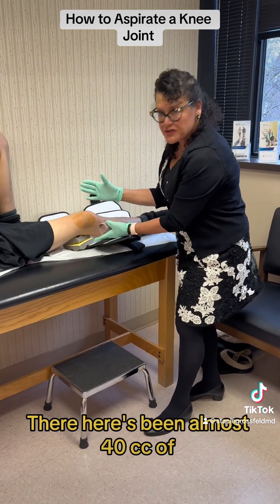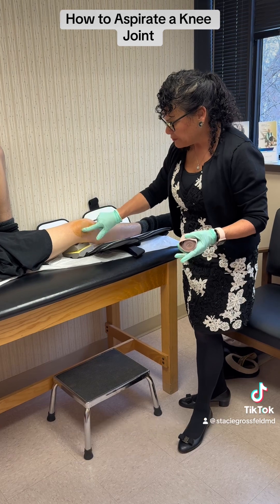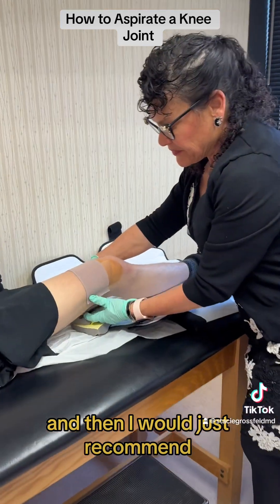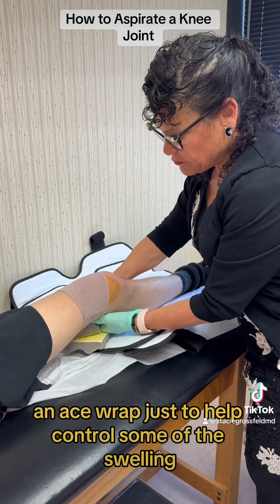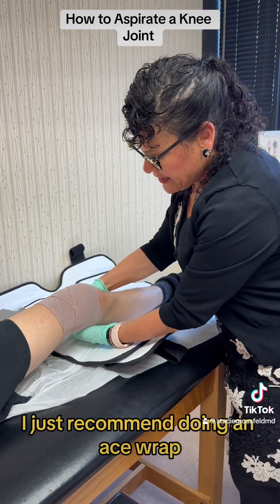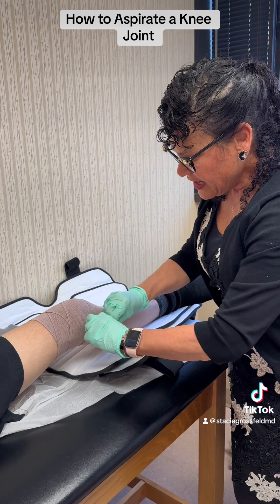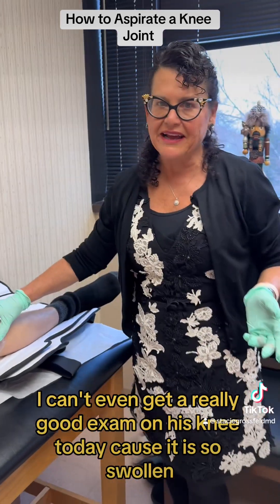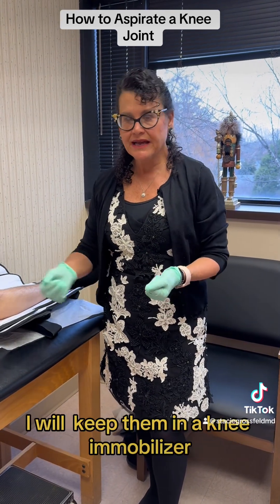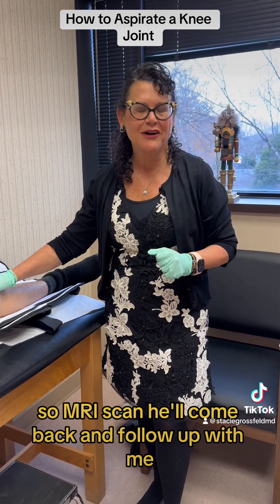Now that there's been almost 40cc's of hematoma removed from the knee, I can see his kneecap much better. I applied a band-aid over the aspiration site, and I recommend an ace wrap — firm but not super tight — to help control the remaining swelling. I can't get a really good exam on his knee today because it's still swollen, so I'm going to move forward with getting an MRI scan. We'll keep him in a knee immobilizer to keep his knee straight and reduce pain, and he'll come back for follow-up.